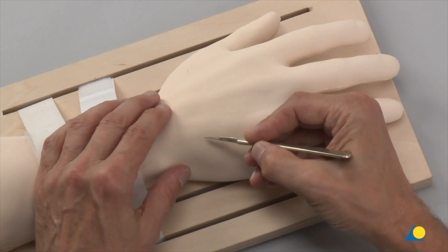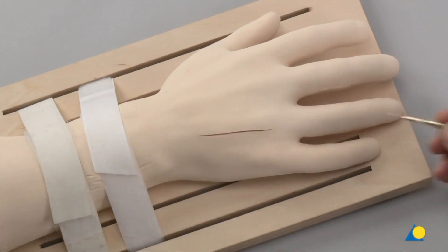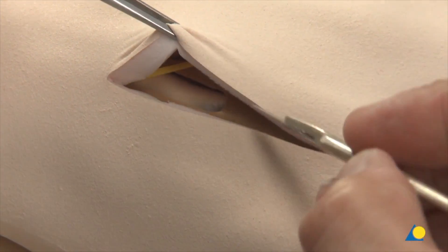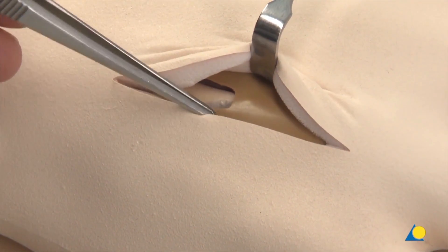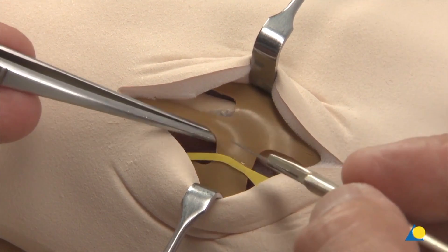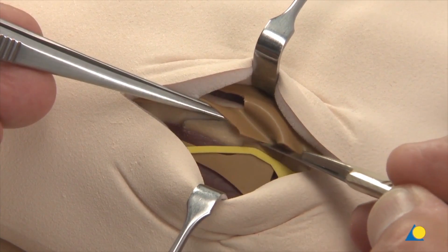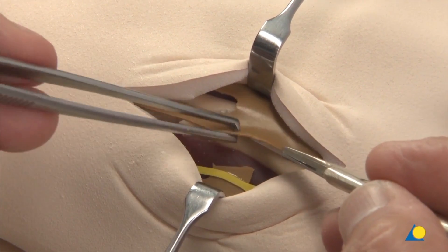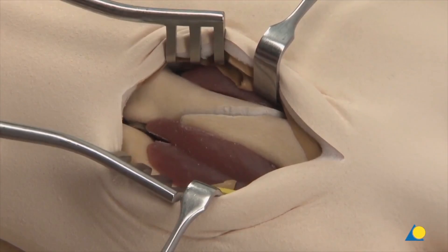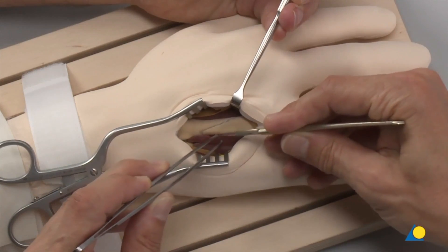The longitudinal incision is made through the soft tissue. The dissection is continued to the level of the extensor tendons. The blunt hooks have been inserted and the extensor tendons are identified. The junctura tendon is held to the radial side to allow access to the fracture site. A small retractor is inserted and the fracture is exposed by detaching the interosseous musculature subperiosteally.